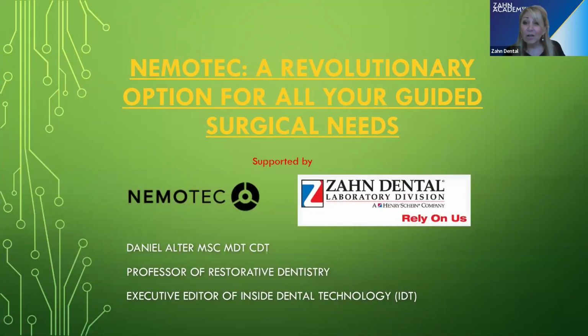Today's webinar is on Nemotec, which is a really revolutionary option for all your surgical guide needs and treatment planning. And it's a great software. And today we have Daniel Alter, who will be presenting for us. So thank you so much, Daniel.